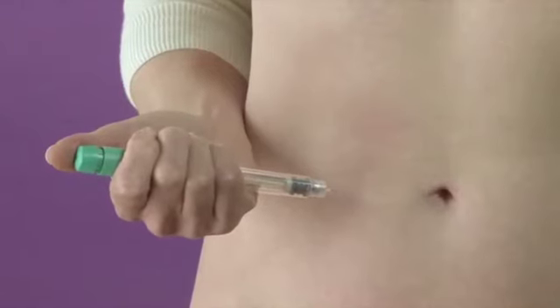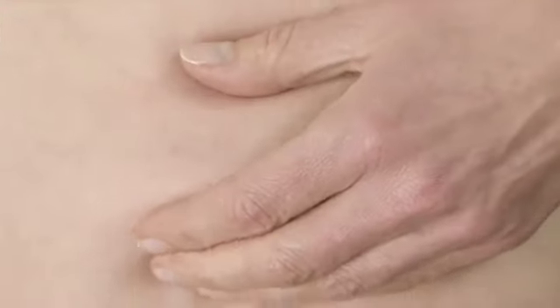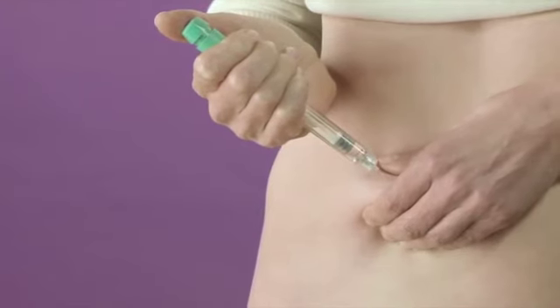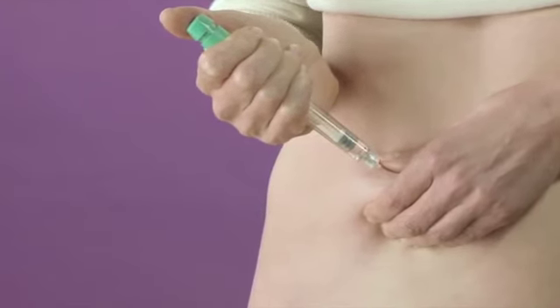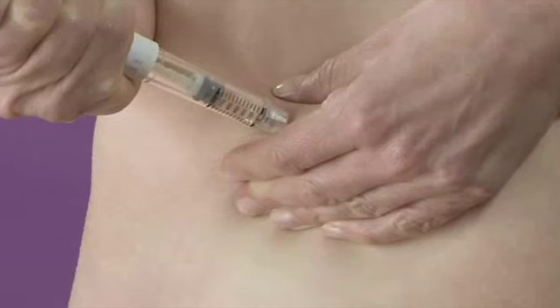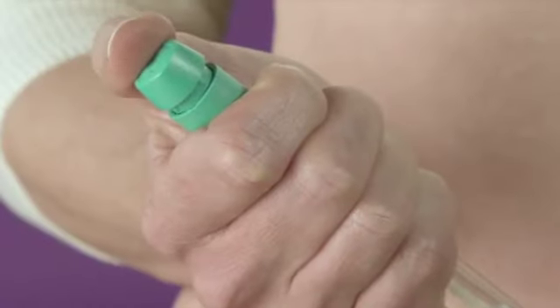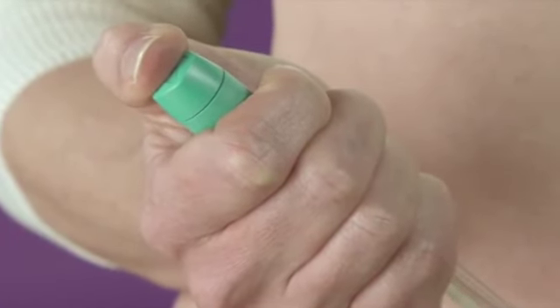Then, hold the pen with one hand and with your other hand, pinch the skin around the injection site as instructed by your healthcare provider. Insert the needle into your skin. Once you have inserted the needle, you can release the skin. Push the dose setting knob right to the end.